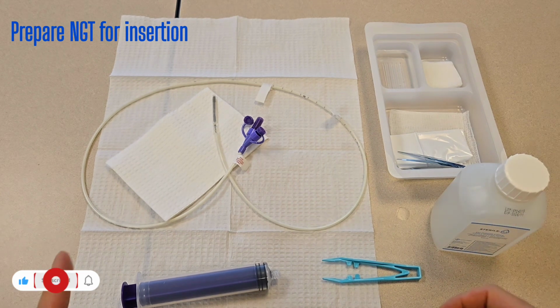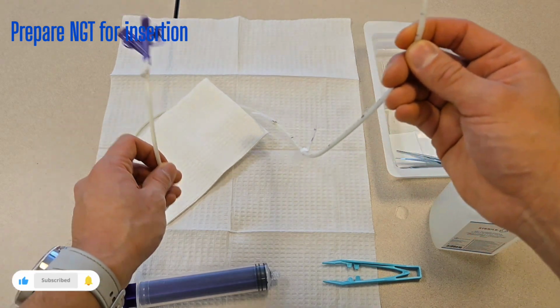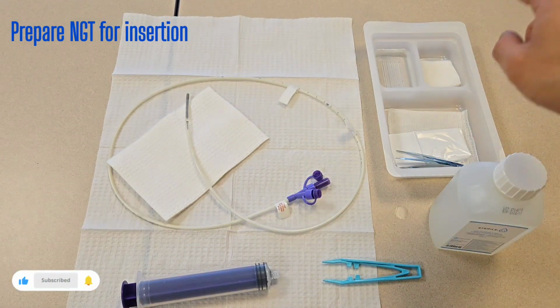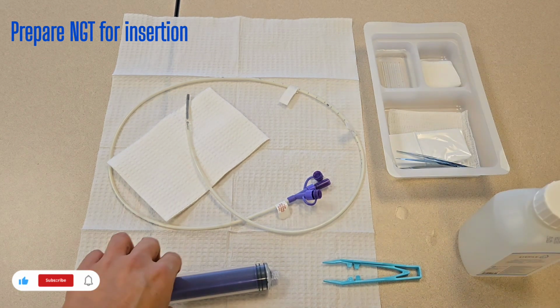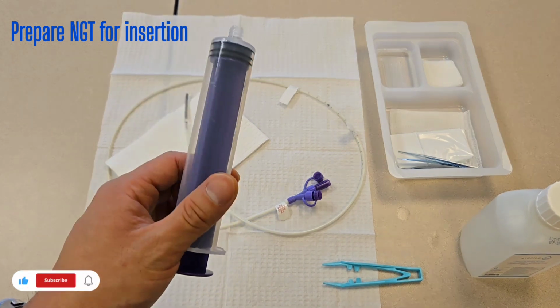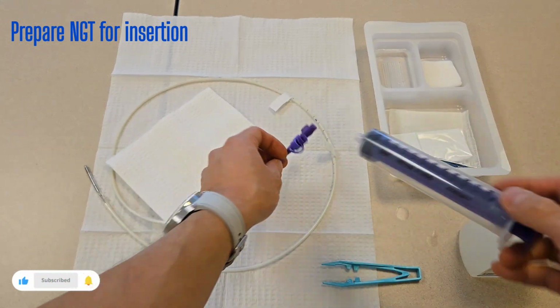All right, team. Next, what we're going to do is we're going to set up our NG and our equipment. Since we already pre-measure our NG for feeding, right? We're going to have a dressing tray. You're going to have some sterile water. You're going to pour some sterile water right here, as you can see. And we're going to have our Enfit syringe. You will know that it is an Enfit syringe because it is purple and it matches the purple on the hub over here.